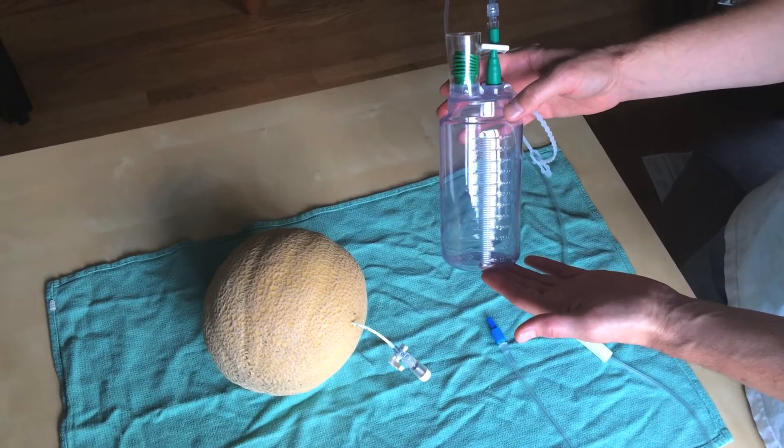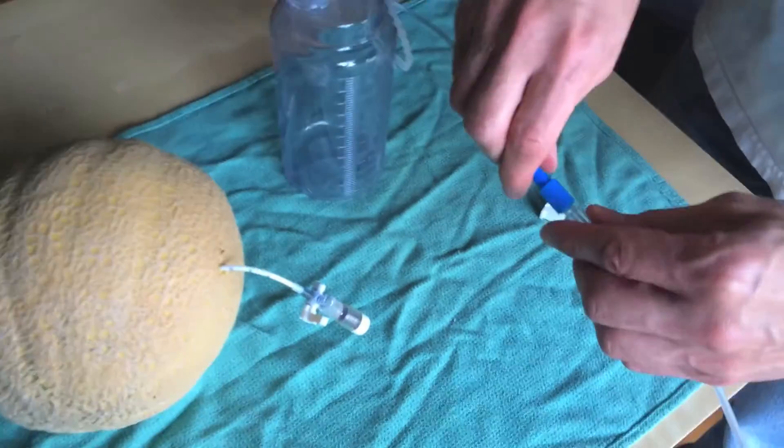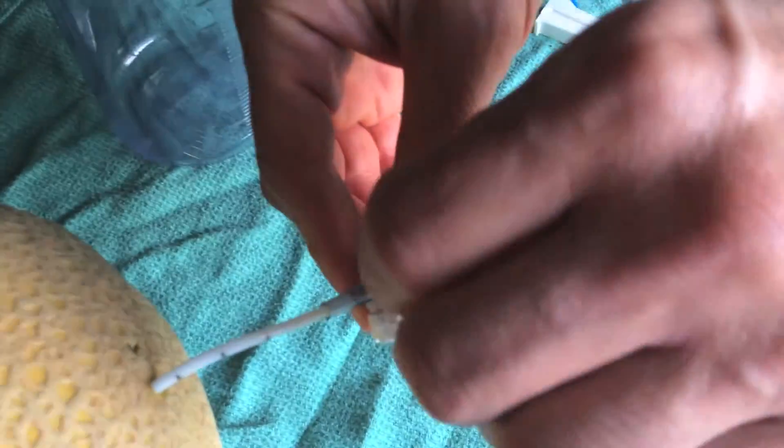The first option for drainage is to use a plastic vacuum bottle. Take the tubing from the vacuum bottle and attach it via a luer lock at the stopcock.